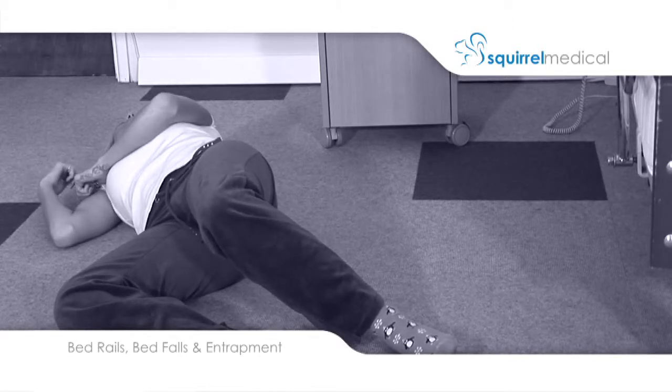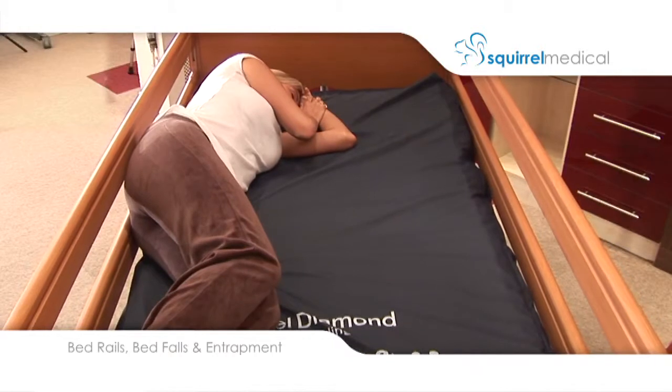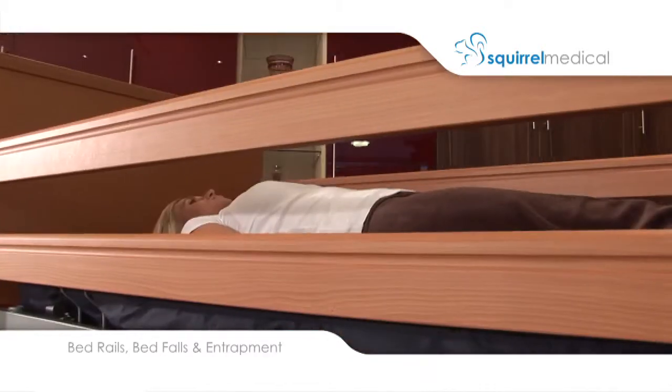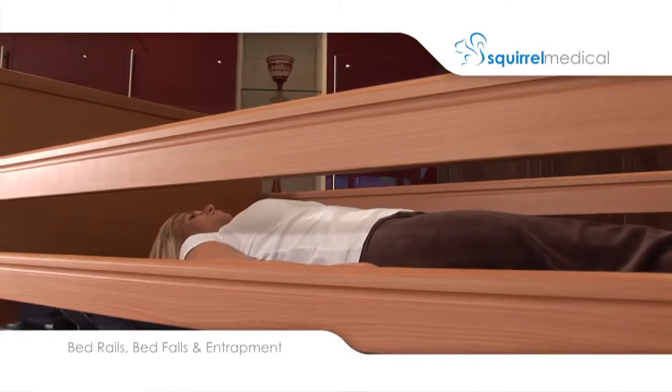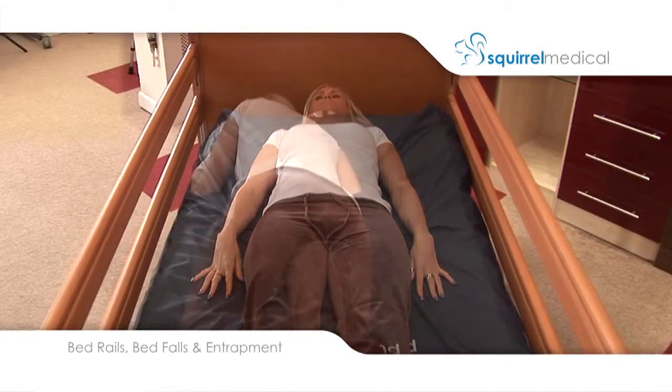Bed falls can cause multiple non-healing injuries, which can be a source of infection and can induce shock. In this sequence, Julie is using a correct bed and mattress combination. A professional assessment has decided she is safer with bed rails, and those provided offer the recommended height of 22 centimeters.